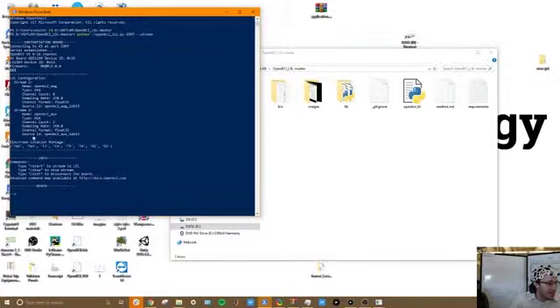And this is the setup that I have. So you can see I'm currently getting the accelerometer data as well as the EEG. So 8 channels, 3 channels.